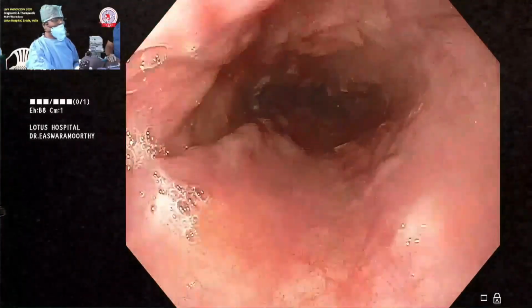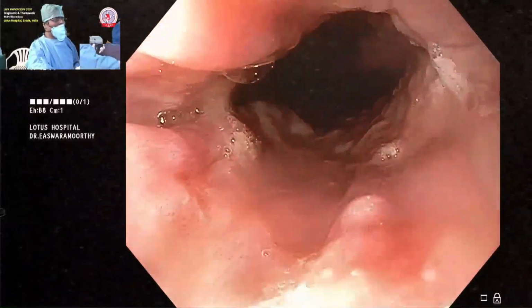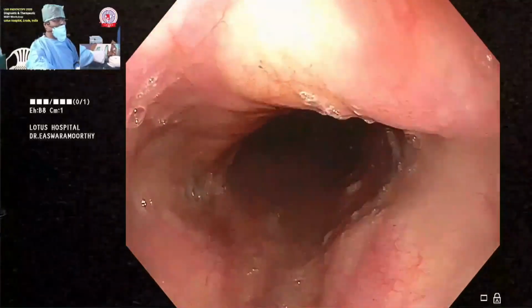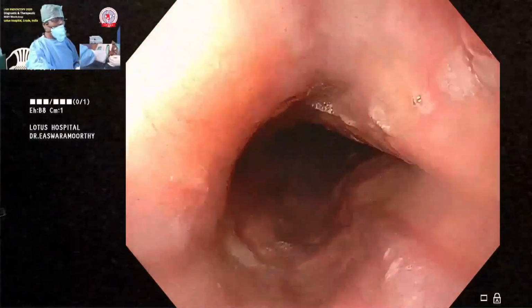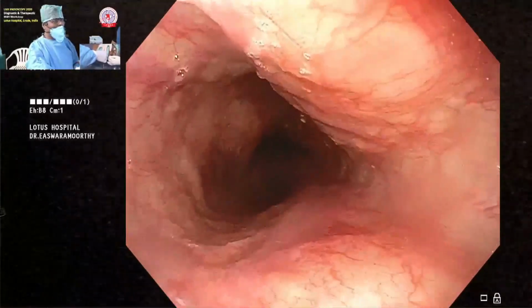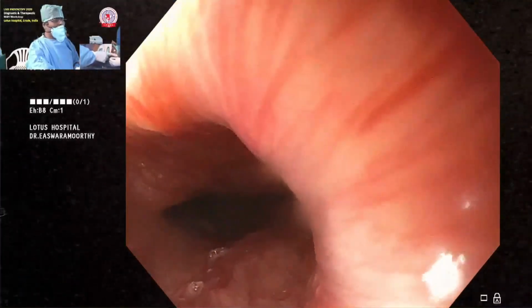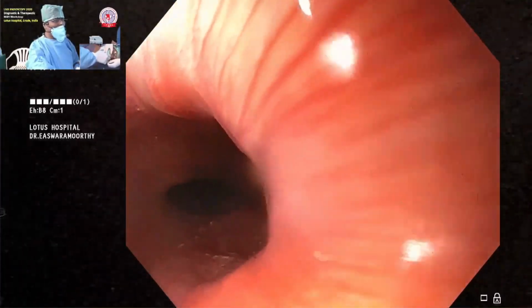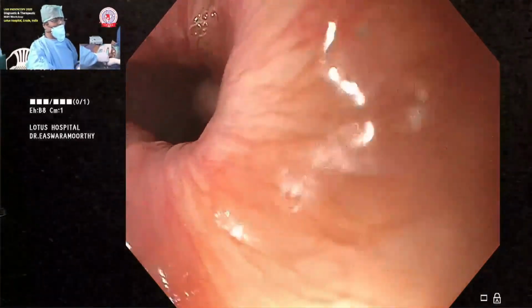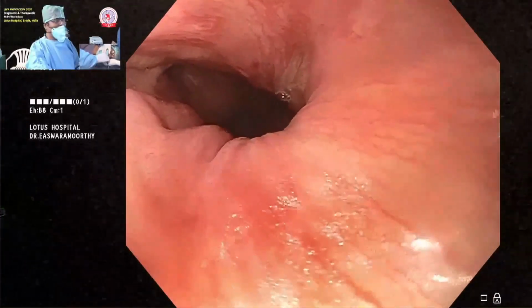Okay, so I'm just keep coming, and you look at my right hand, I'm actually kissing the patient's mouth, because when you have the hand right on the patient's mouth guard, your control on the shaft is so good, you can take it a millimeter at a time, otherwise if the patient is retching, he'll vomit. And also you have to instruct your staff nurse, in case you are taking the hand from here to the shaft, she will hold, so she will do what you are doing. So I'm just coming out, and you can always teach the staff what level you are at.